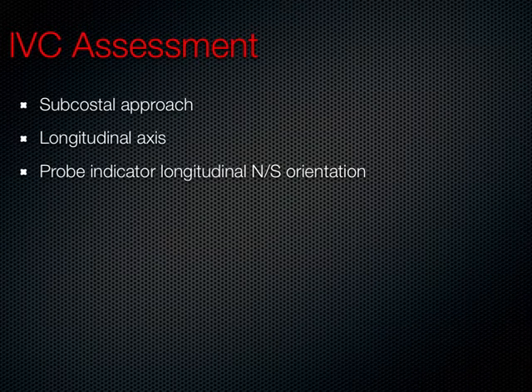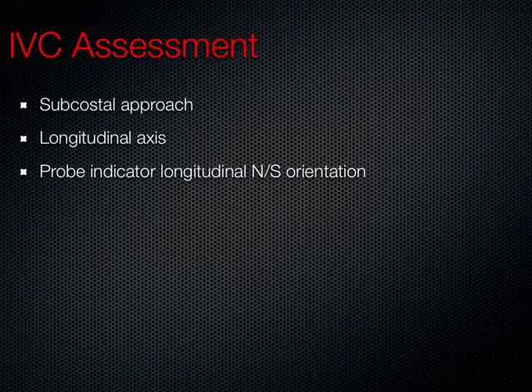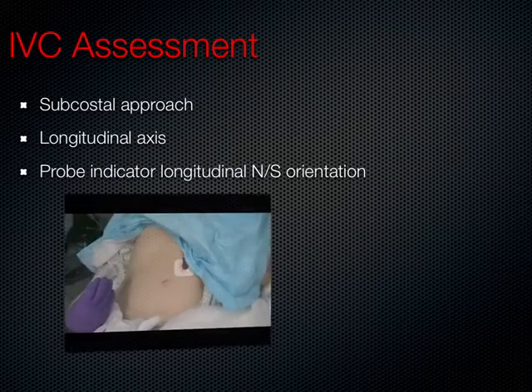From the subcostal approach, we can turn the probe 90 degrees to obtain a view of the inferior vena cava in its longitudinal axis. In this view, the probe orientation indicator is oriented north-south. Depending on whether you're trained by a cardiologist or an emergency physician, it's either north or south — it doesn't particularly matter since this is a tubular structure and either way you're just trying to get a long axis through the inferior vena cava.